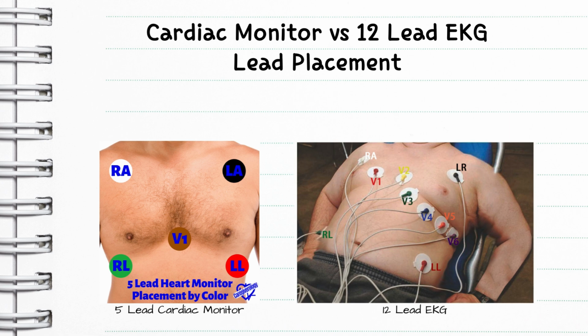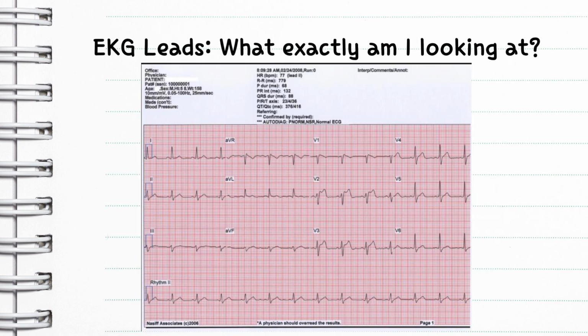But it should be quick. Now, there are some little terminologies that a lot of people use, like clouds over grass, smoke over fire, and brown in the middle for the 5-lead. Sometimes you have a 3-lead heart monitor, and I've always learned it as salt, pepper, ketchup. So salt, pepper, white, black, ketchup. It just goes that way. And then I always just throw the green, if there's extra, there's green or brown. That's just how I've always done it, but you can do it whichever way you want.